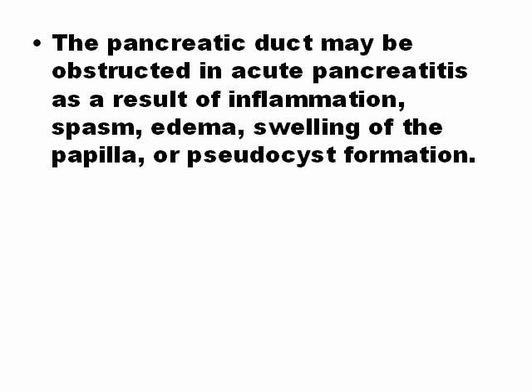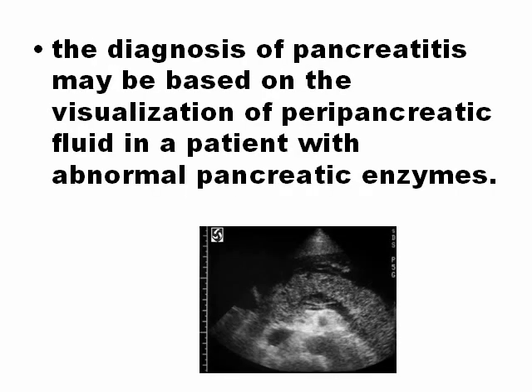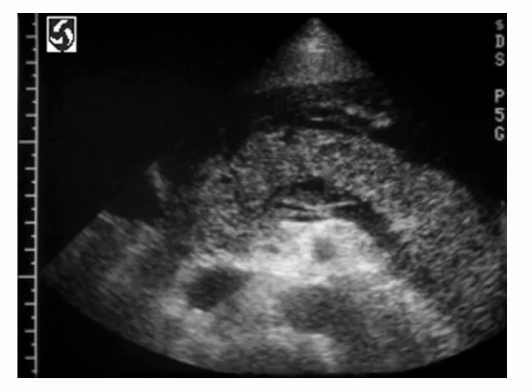The pancreatic duct can sometimes be obstructed as a result of inflammation, spasm, edema, swelling, or pseudocyst formation. The diagnosis of pancreatitis with ultrasound is sometimes made by visualizing peripancreatic free fluid in a patient with abnormal pancreatic enzymes in blood. In the picture, you can see hypoechoic areas anterior to the pancreas — this is free fluid in acute pancreatitis.